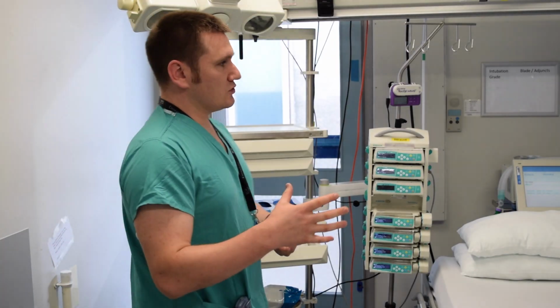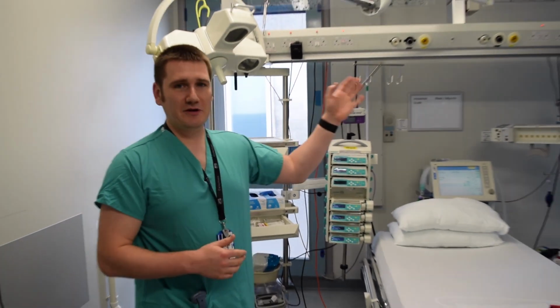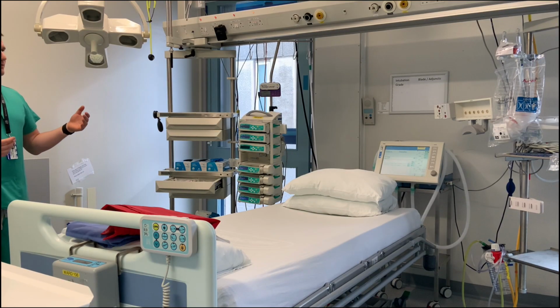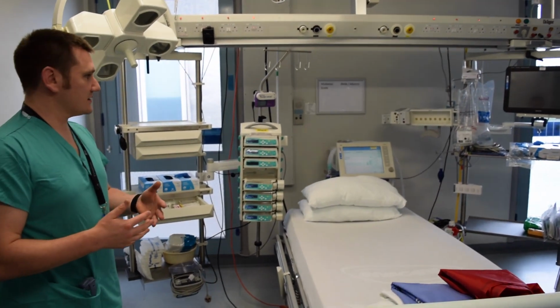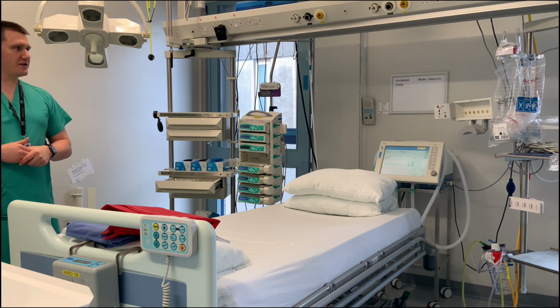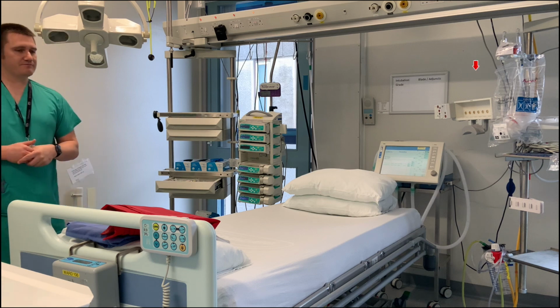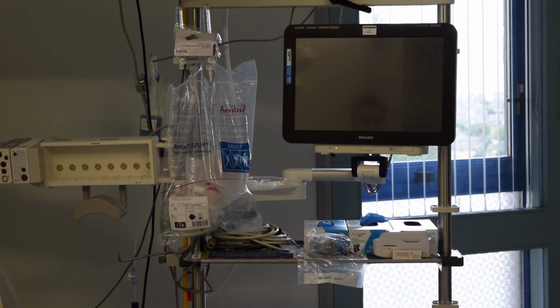Moving more specifically on to the equipment around the bed space, you've got a significant amount of power points to supply power to potentially a large number of devices beyond what you can see here. As a basis, you will find monitoring, which is over to the right hand side here. That's that Philips screen. That's real-time monitoring that will be connected to the patient, and there are a number of modules that can be attached to this bay to the immediate left as you look at it. We'll go more specifically into some of those in a few minutes.